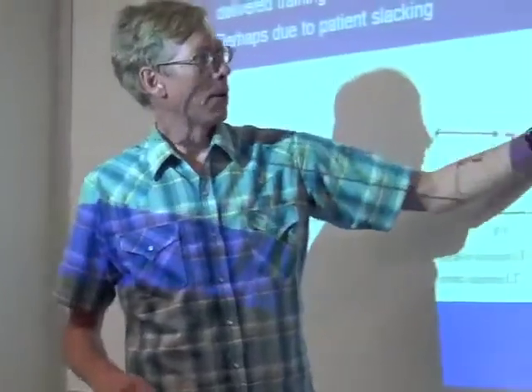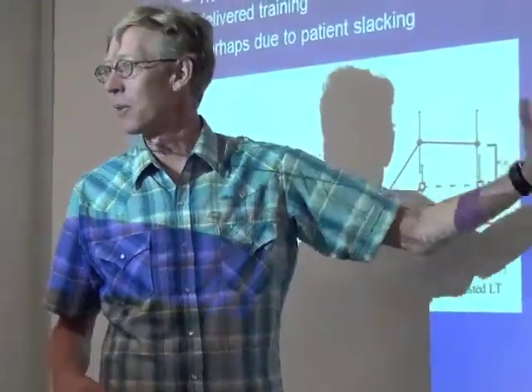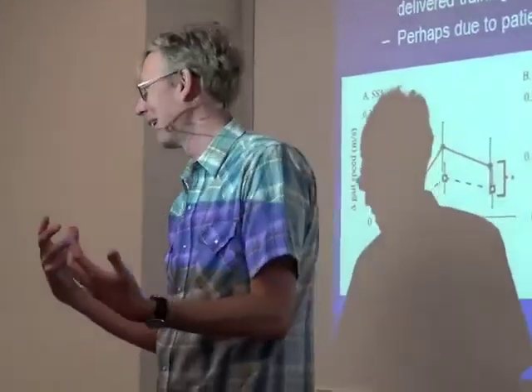So they actually measured energy consumption, using oxygen measurements, when people were walking in this versus when they were being assisted by a therapist. They found that when you're being helped by a therapist, you were consuming about twice as much oxygen as when you're in the robot. So indeed, it somehow is encouraging you to be passive, even though you don't consciously think, I'm going to become passive. An obvious potential solution is computer gaming, where you can measure the forces the person is generating in real time and have your game encourage active motion by the patient. And that's what that company is doing.